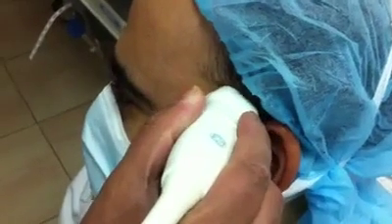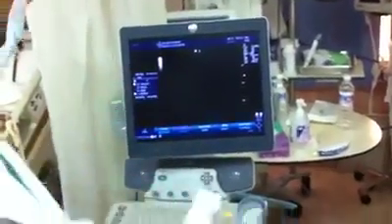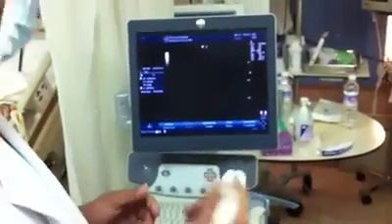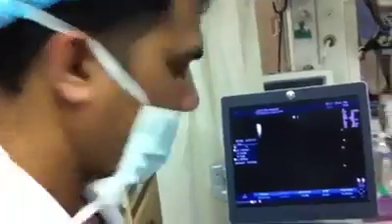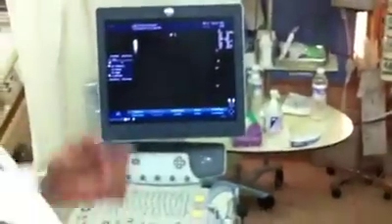This is the first video on how to do TCD. This is a probe, a 3S probe, and any ultrasound machine can have a protocol for TCD. You can ask your company to provide the TCD probe and protocol with it.